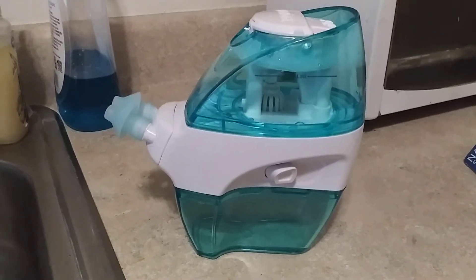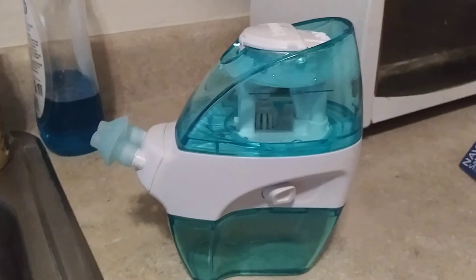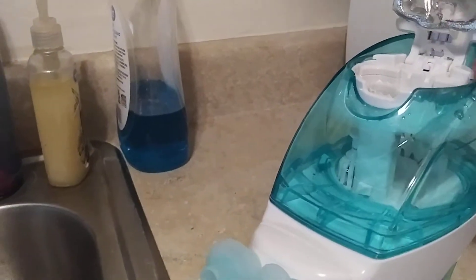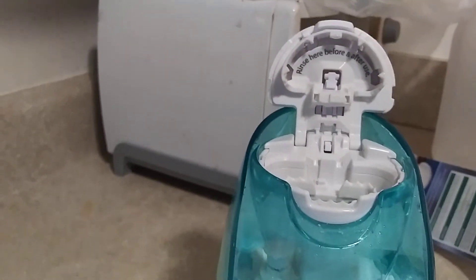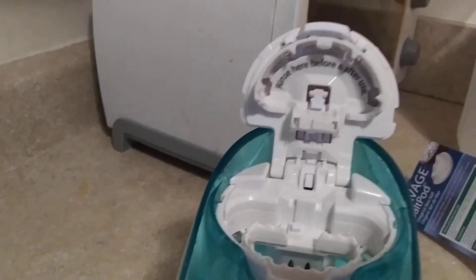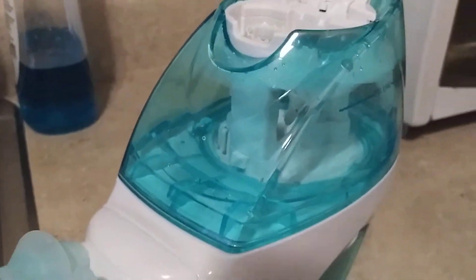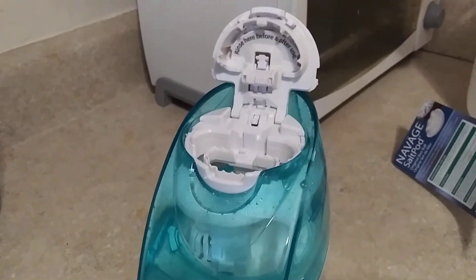After I finished using it I cleaned it and let it air dry. One thing I didn't do — I'll be honest — was take the top off to rinse it before and after use. But I've been doing that too, and it's still not working.